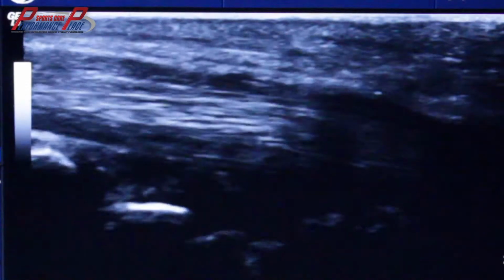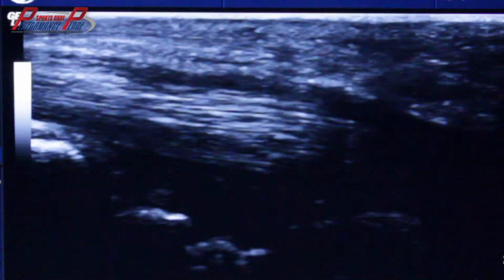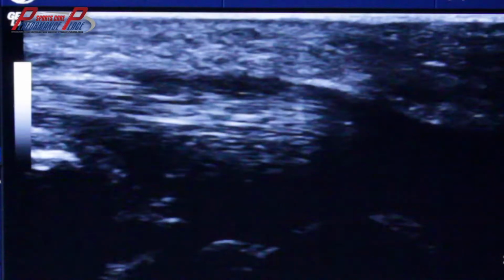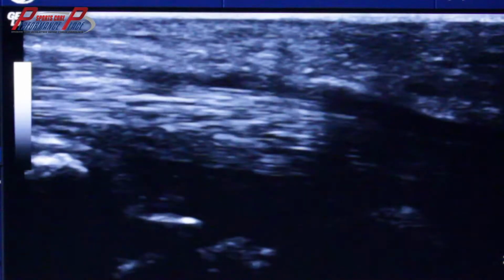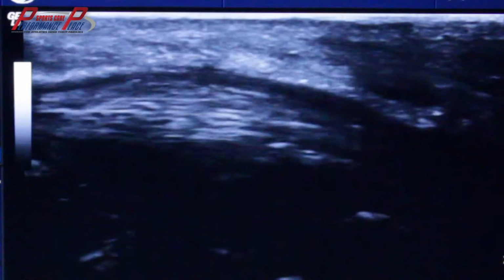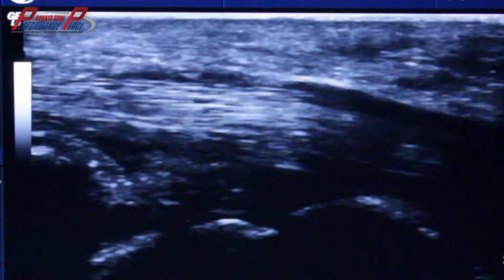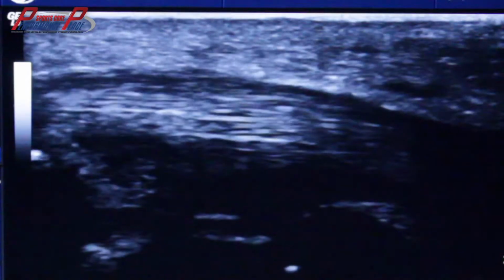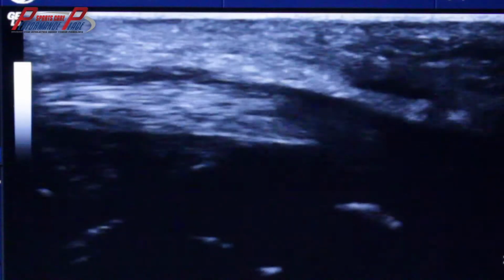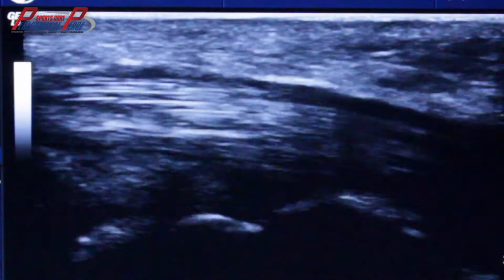Now, see, it's even pulling the tendons a little bit. And now I'm relaxing. So this might not be very visual to you guys, but I can feel a pretty big nerve pull on the side of my brachial plexus right now, on the side of my neck. So this movement to the left of the nerve and now to the right of the tendons, because I'm extending my fingers, is a pretty big deal. And it's a big deal because we need to make sure our nerves slide well amongst the tissues that they pass through. If they don't, then we're going to end up with a bunch of nerve-related conditions.